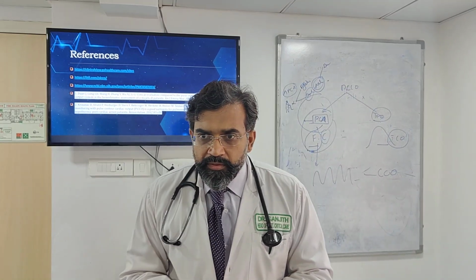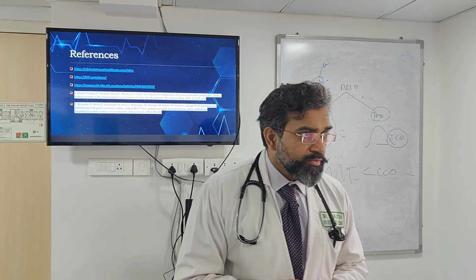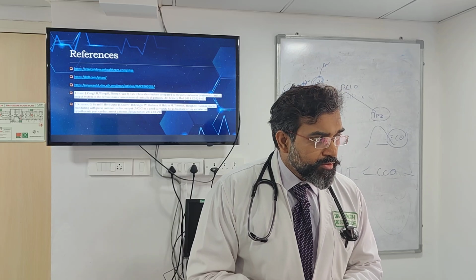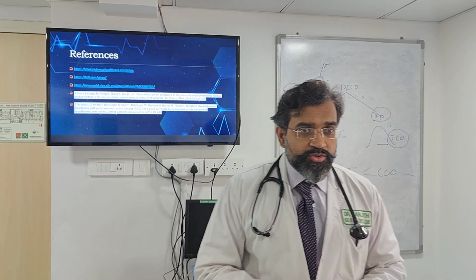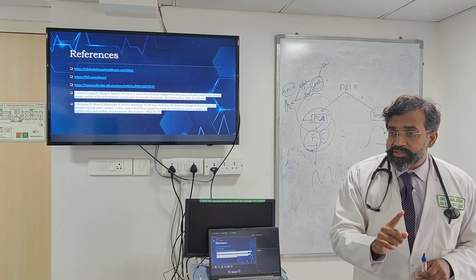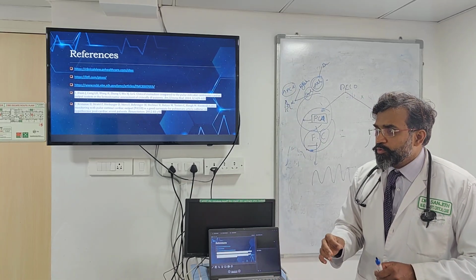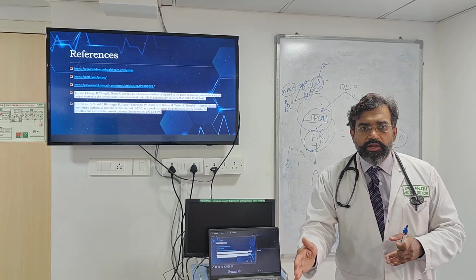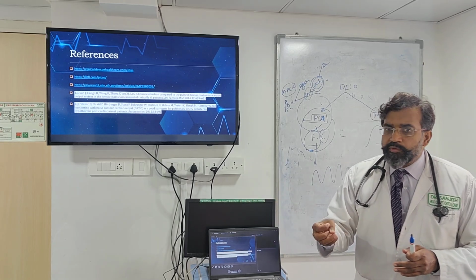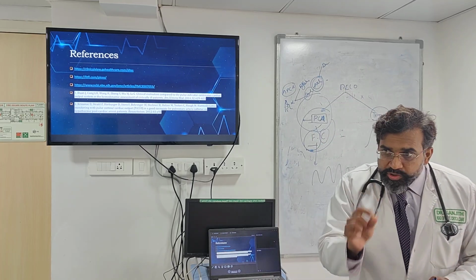Same reading if repeated? No. When will you do it? Change in position and if the inotropic support increases. That is the answer. So in the event that your vasopressor support actually changes, what is going to happen? If you say go from 10 ml to 6 ml NORAD, 6 ml to 10 ml NORAD, you made a change in the vasopressor. What is going to happen here? The compliance is going to change.